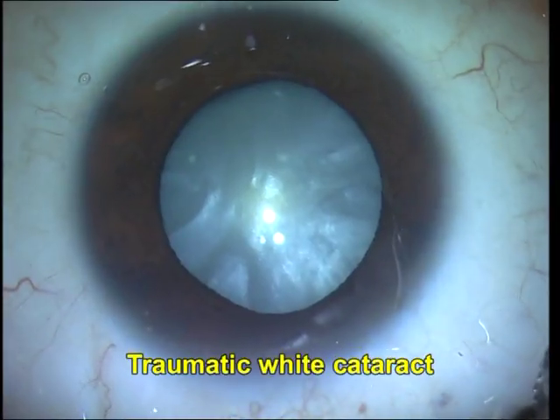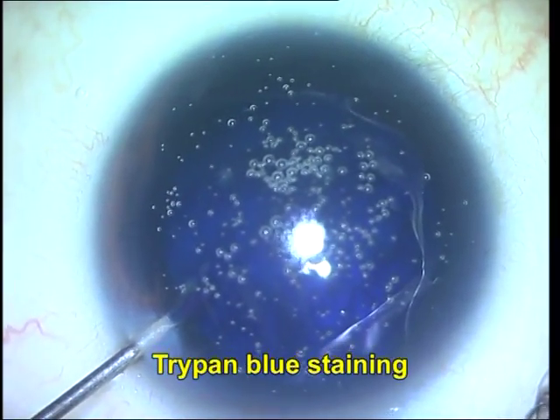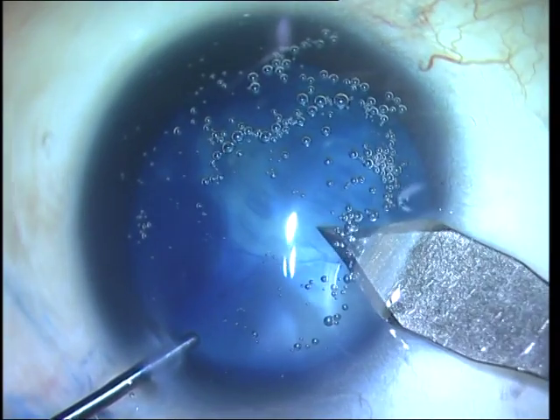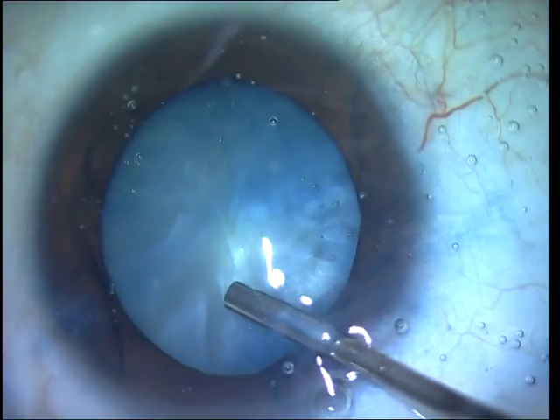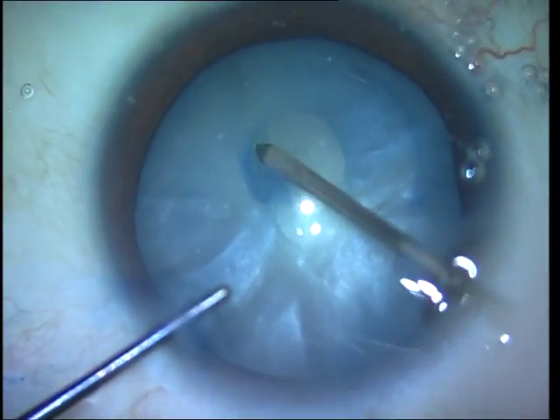The next case is that of a traumatic white cataract. These cataracts may occur following penetrating or blunt trauma. If the surgery is performed soon after trauma, it may be composed of only soft flocculant lens material or it may have an endo-nucleus depending on the patient's age. You can see that I have stained the capsule with trypan blue.